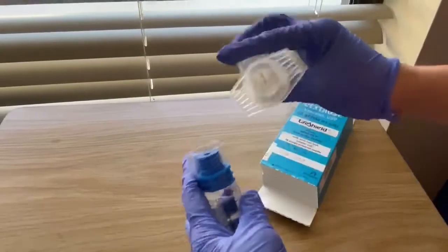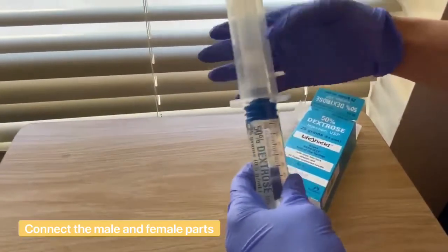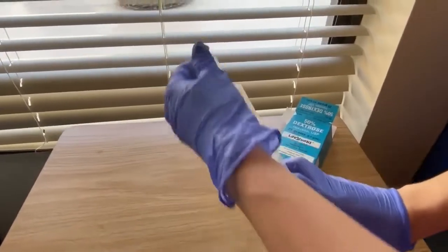You just simply pop off those two yellow caps like that. And then you're going to connect the male and the female parts like so, twisting it righty-tighty like usual. And then the very top there has a large syringe needle.